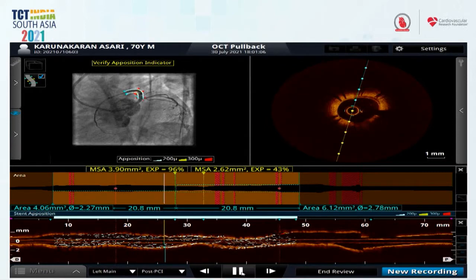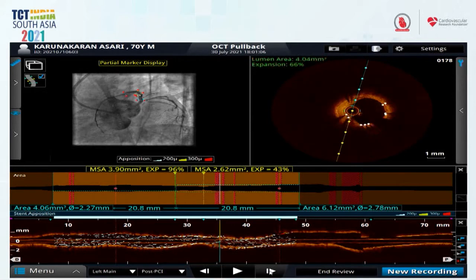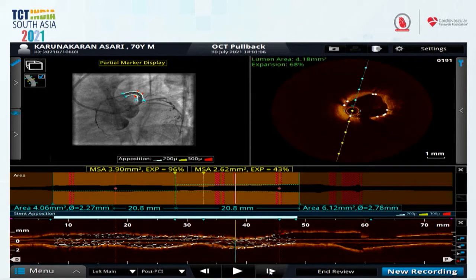We did that because we just wanted to slowly move here. Just see that the area was 4.1 with IVUS. Just see that smallest area here. So 2.62, 2 point something, 2.6. And do you think it is an underexpanded stent, Jihad, or neointima? I do believe this is an underexpanded stent. If you look at the reference markers by the OCT, the distal reference is 4.06. So this is probably an underdilated, originally deployed stent.